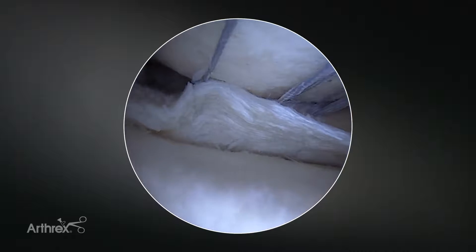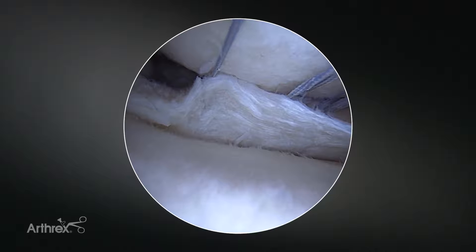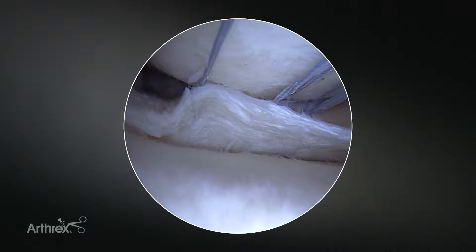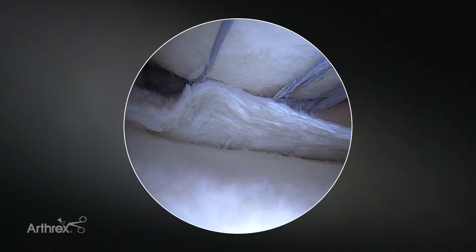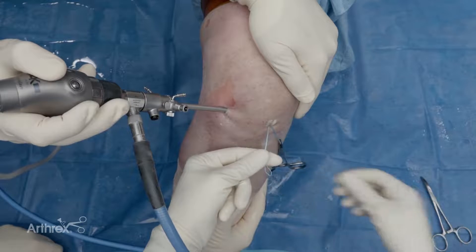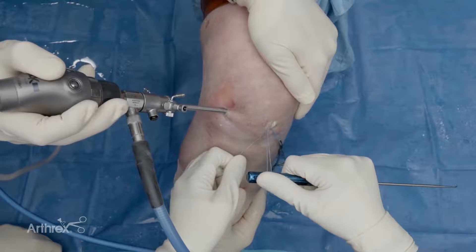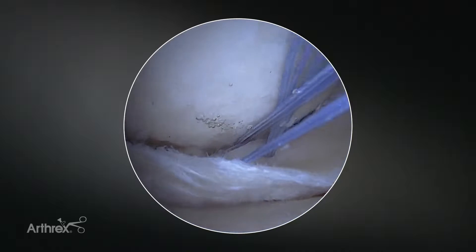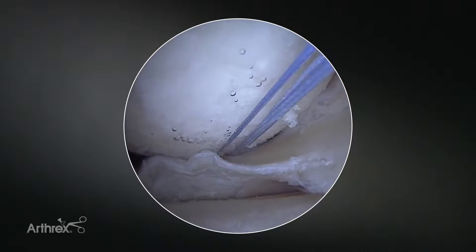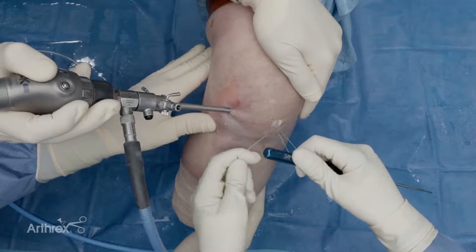So it's nice to have all these placed at once. At this point you can come through and cut that suture. Alternatively, you can tension all three of them and then cut them sequentially at the end. Now we're going to take our second suture, which is clamped — we unclamp it to keep everything separate. We've already set it, so we take that first loop, tension it down, and then the free strand. You can see how that's nicely continuing to tension down the femoral side. And now our final stitch here on the femoral side.